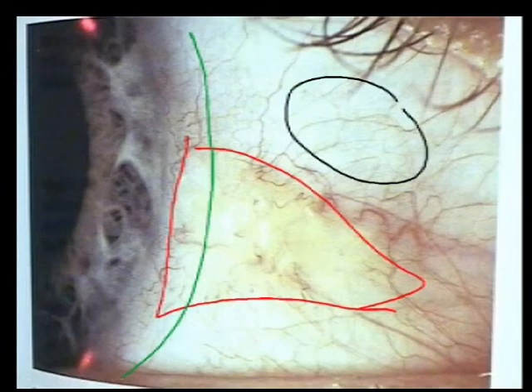It's risen up toward you a bit. And you can see that it's discolored. It now has more of a yellowish appearance. And that's a change that we would want to note in the conjunctiva on pre-fit as well as on subsequent visits. And what we're seeing is something that you probably see every day because we live in Florida. And that's the degeneration of the bulbar conjunctiva in response to excessive exposure to ultraviolet light. And in the conditions, we'll talk about this, and this is simply known as a pinguecula.